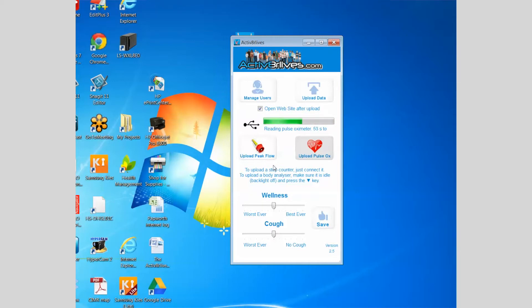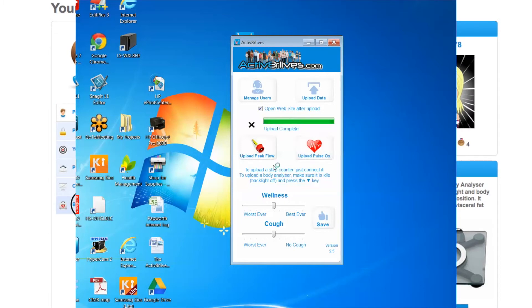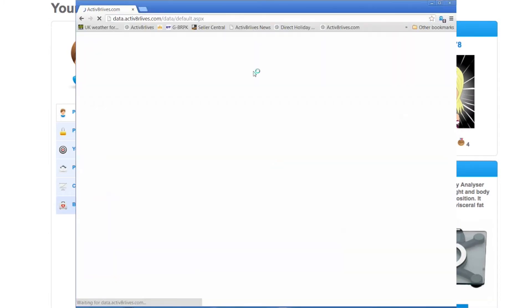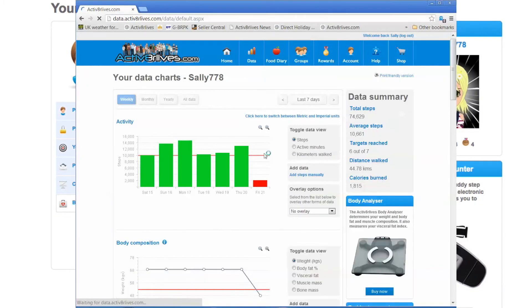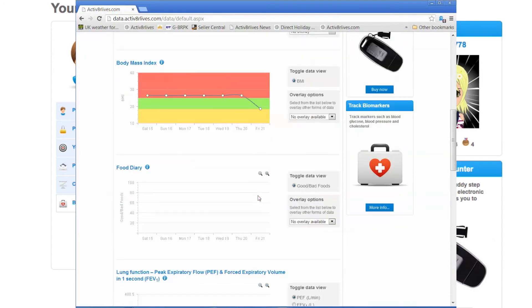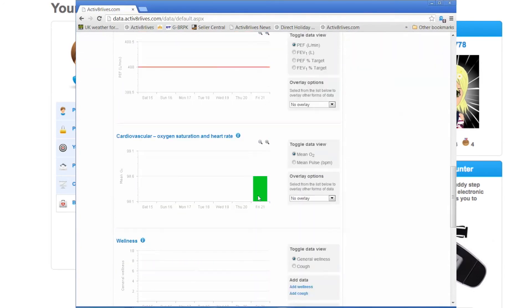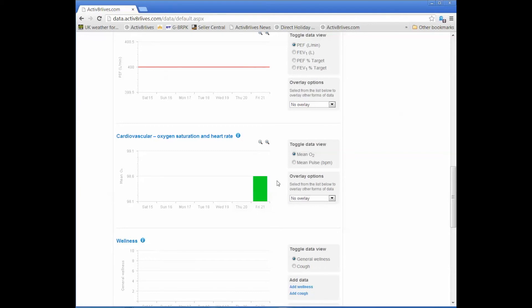Once the reading process has been completed, the average for the duration will be automatically uploaded to your account. Once upload is complete, you can view your data on Activate Our Lives by going to Account.